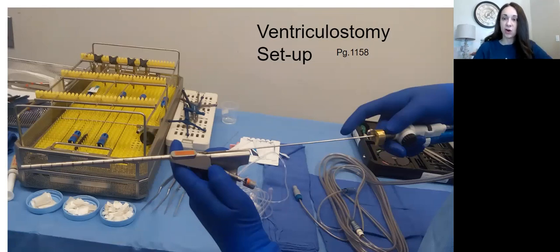So it's a crani setup, but you're going to have a camera like a scope and then a very skinny version to go into that ventricle. Sometimes we had a fiber optic camera that would go through something like this, so it was even tinier. So minimally invasive is the name of the game. Okay, after ventriculostomy, let's go over that one. So you see your setup.